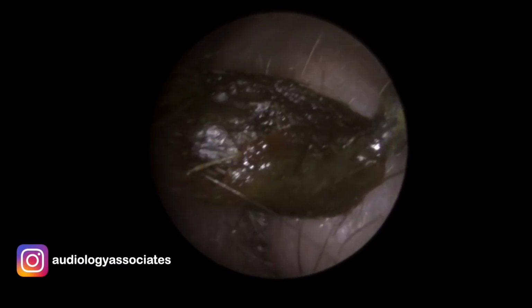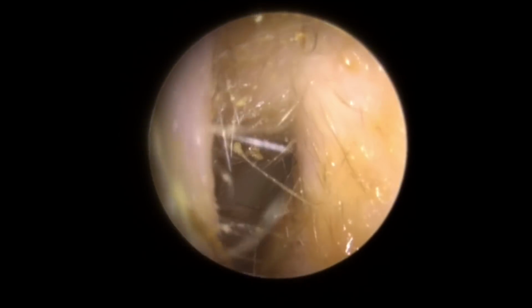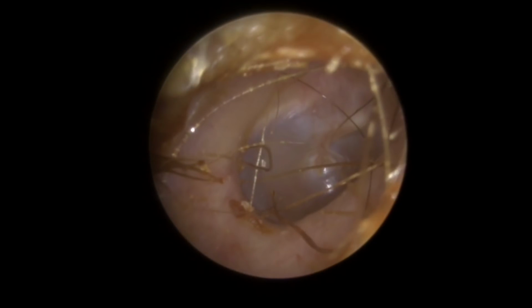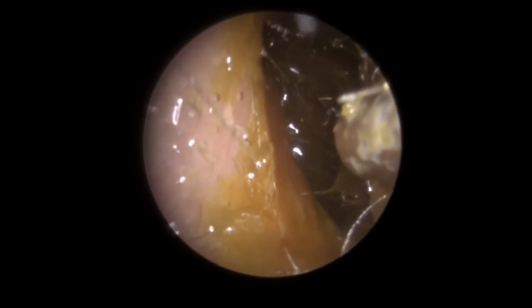You can see it's quite long, thick. You can see how dark the colour is. Lots of bits of hair, and you'll see there's quite a few little stringy bits of hair left in here. Now those can wash out with the next bath or shower. It's really difficult to go in there and take those little bits of hair out like that. You can do it with crocodile forceps, but they'll come out just as easily with a bath or shower next time.